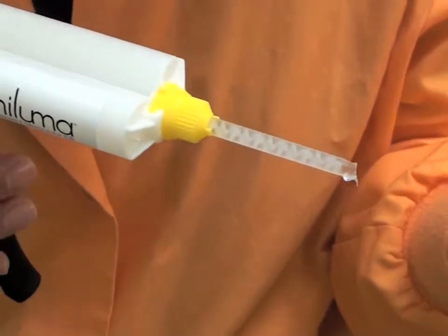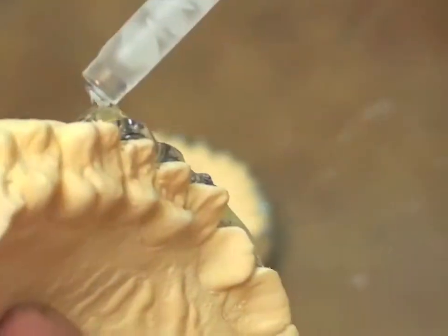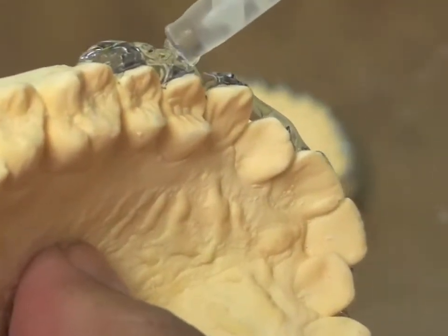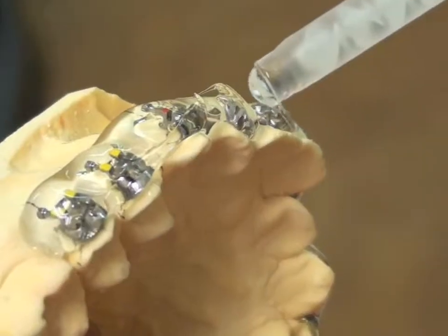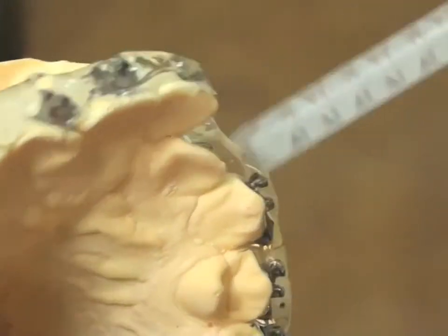Emaluma is a clear PVS impression material that has very low tear strength for easy release and is ideal for the first layer of the custom tray. Slumping can be reduced by adding several layers in a back and forth motion. We encase all sides of the bracket to reduce flash.